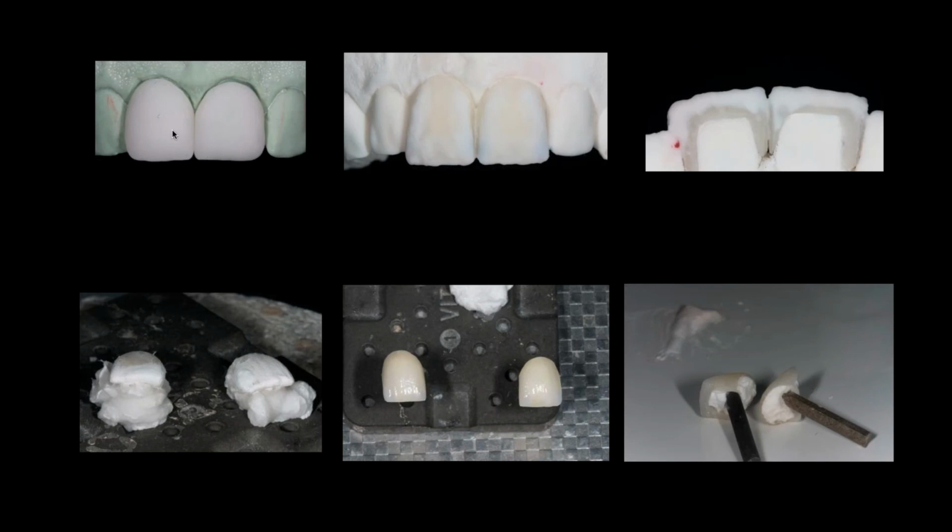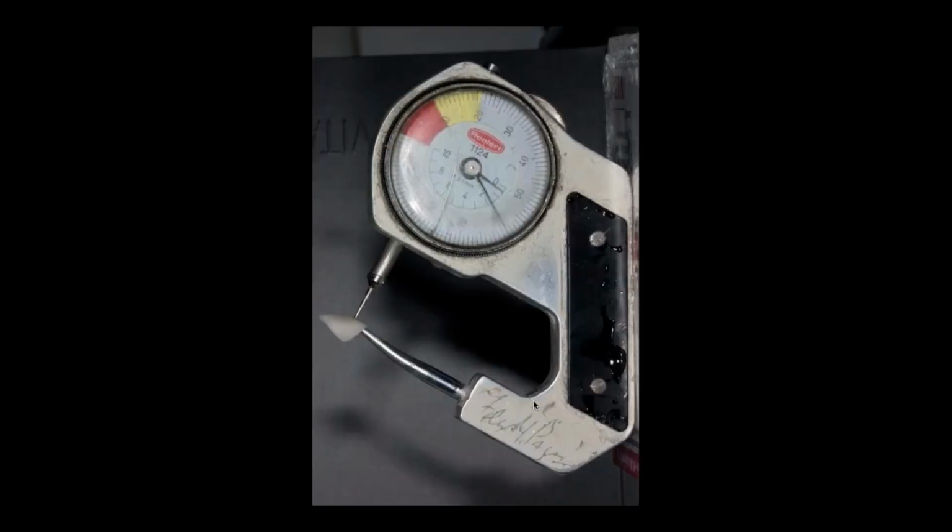Here's the shells. Here's the buildup. Here they're fired on a putty. You can also fire them on sticks like this, like the VITA pegs, that's what I do now. And you just grab the furnace tongs and grab them proximally and push them in. That way you don't ruin what you did, like if you have to characterize it a little bit. And these are 0.6.